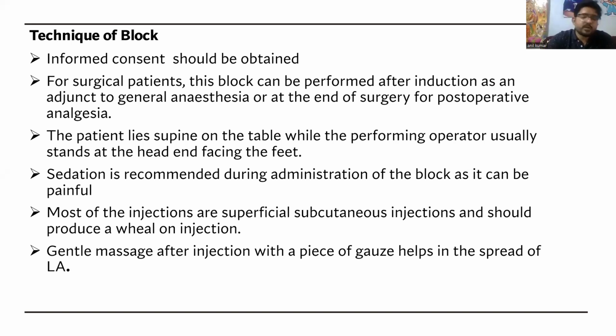First of all, in any technique, in any block, you must take the informed consent. You must explain to the patient about the block, the procedure, and what you are doing, because if it is an awake craniotomy, the patient is awake. So you must explain to the patient. And for surgical patients, this block can be performed after induction because it will be somewhat painful.